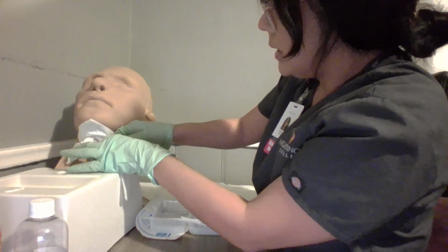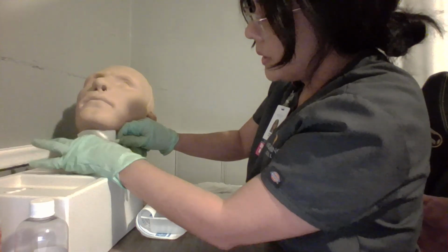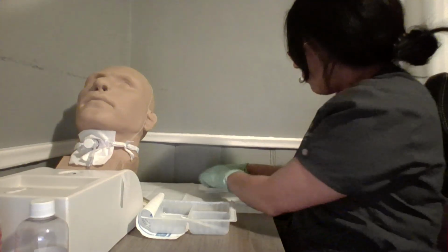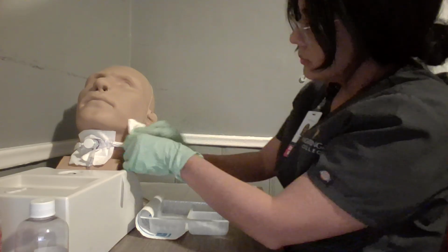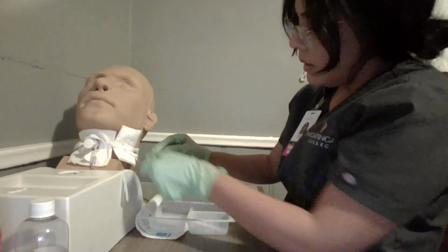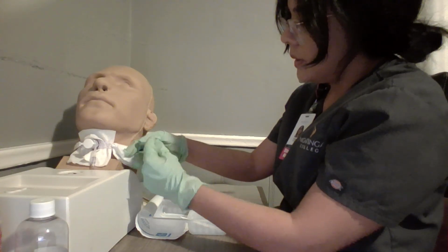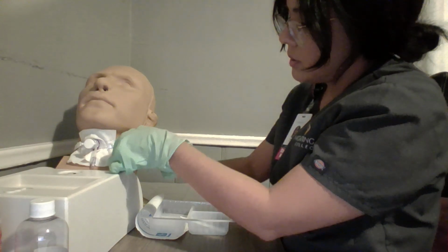And I will take a folded 4x4 square and place it under the knot. I will use tape here. Make sure that the tape does not touch the patient's skin.